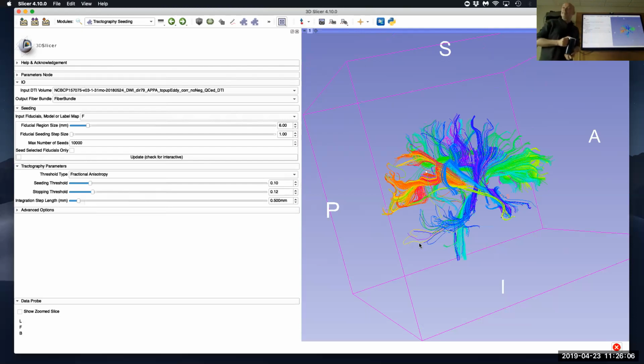Is there any way of automating the placing of the markers and getting those images out in case you have, say, 10,000 scans you want to do quick QC on? Well, you probably could. One can just take a simple template space, place those landmarks there, which is the template, do a simple affine registration, and propagate the landmarks that way, and then do an automatic tractography. The problem still is somebody has to look at it. An automatic quantitative assessment of that tractography is probably possible, but non-trivial. One would have to first develop that.